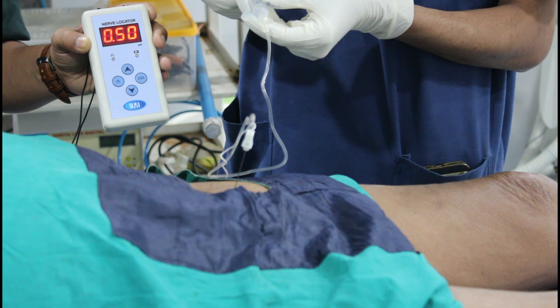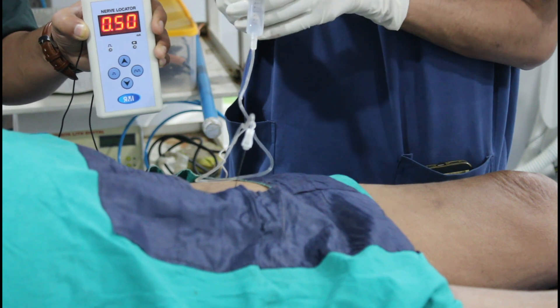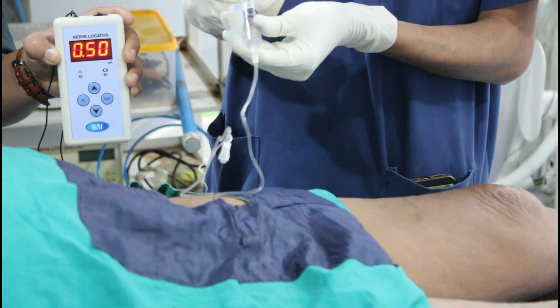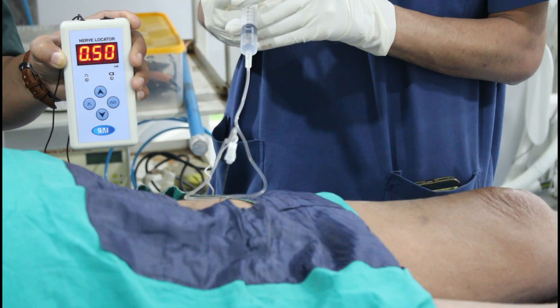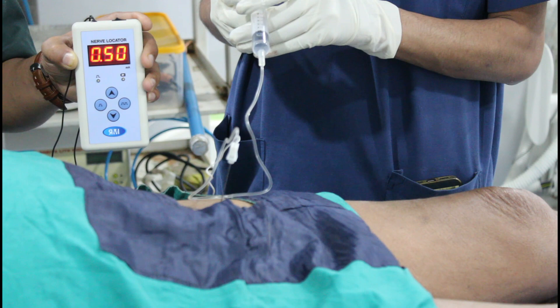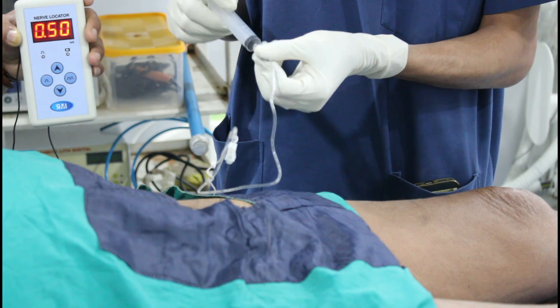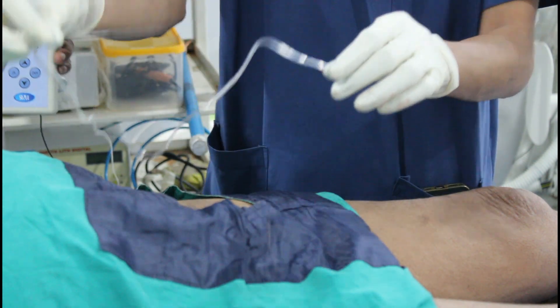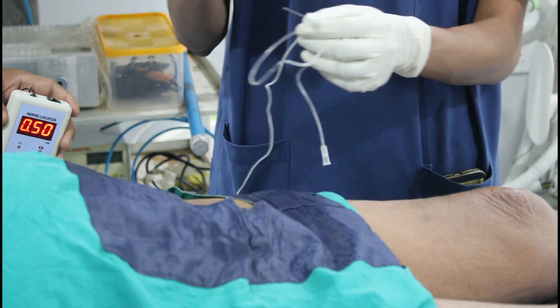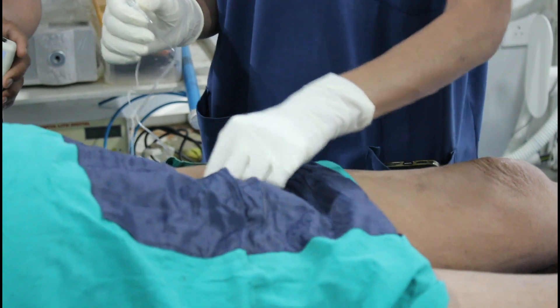I am injecting 1ml of local anesthetic. Contraction has disappeared — positive Raj sign confirmed. I will now inject the remaining local anesthetic solution, aspirating every 3 to 5ml. Around 3 to 4cm depth I located the obturator nerve in the inguinal region. Aspiration is negative and I have completed the PNS guided obturator nerve block. After giving the block, I am gently rubbing the area to get adequate spread of the local anesthetic mixture.